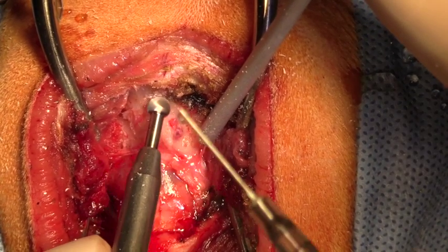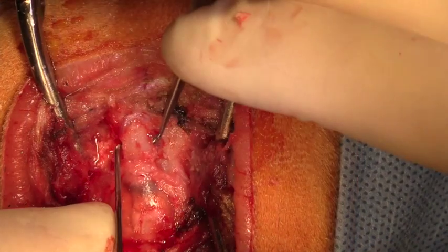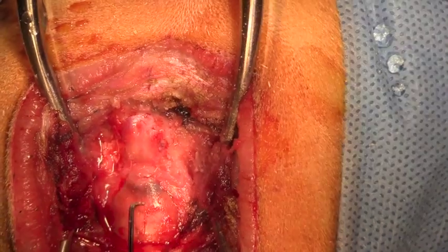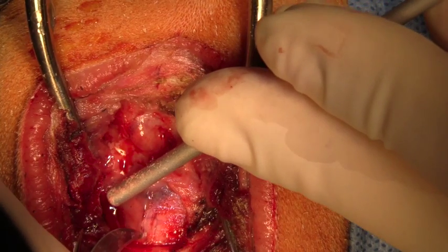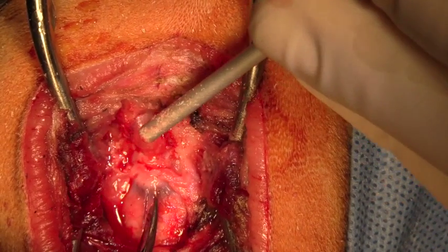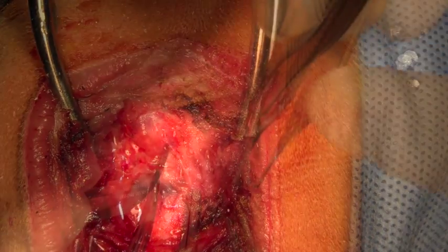We use a high-speed burr with irrigation in order to drill through the bone just above the foramen magnum and remove that small piece of bone. Now we're using a blade to cut through the dura mater and you can see cerebrospinal fluid which is leaking out, and we're extending that incision in the dura mater up over the vermis of the cerebellum.